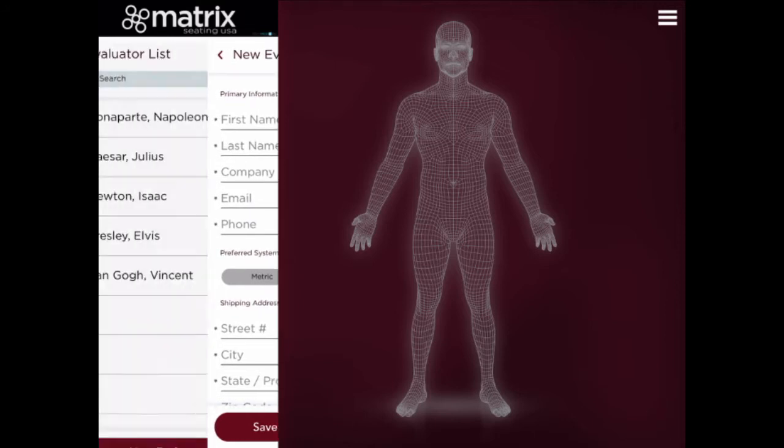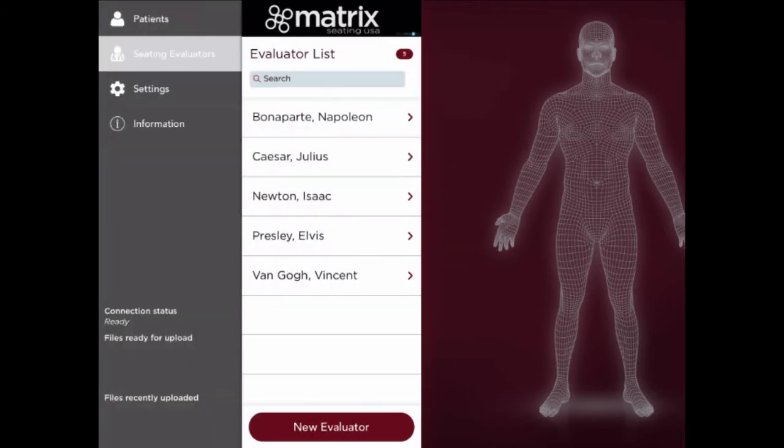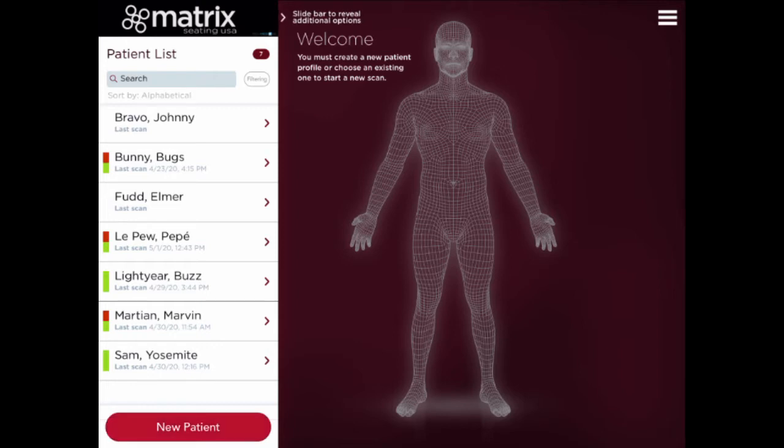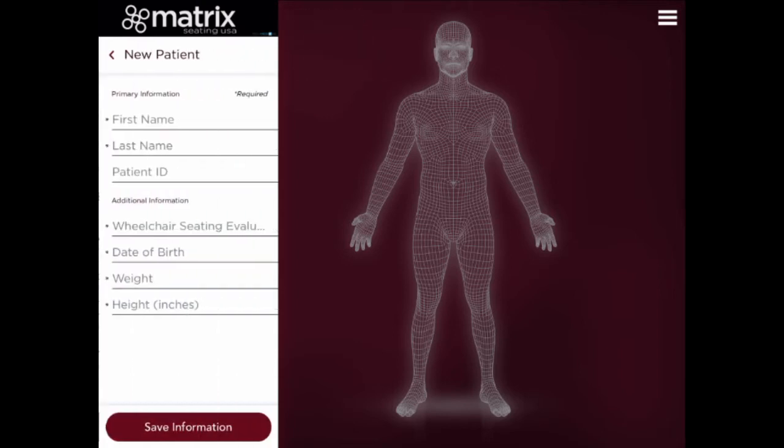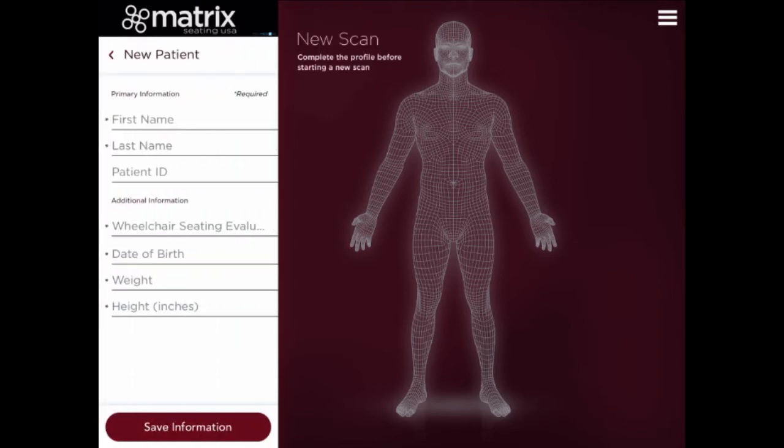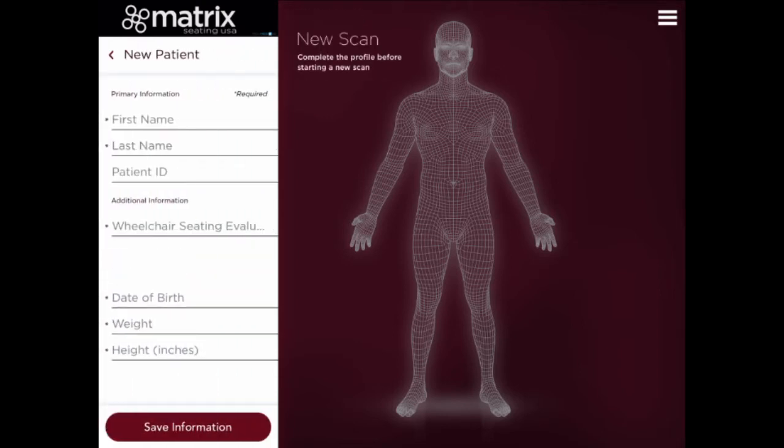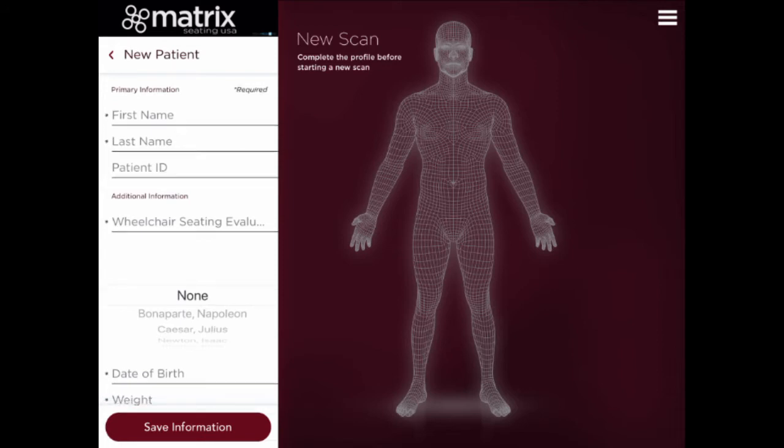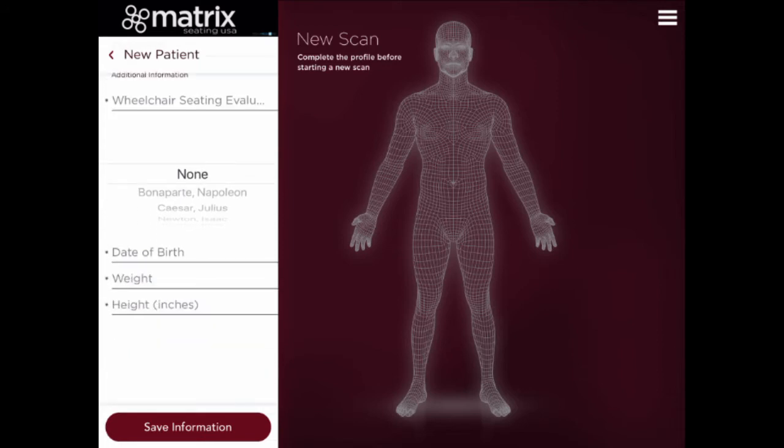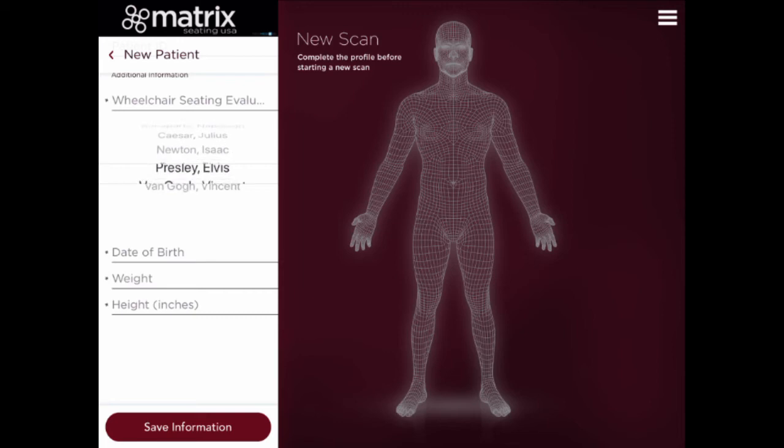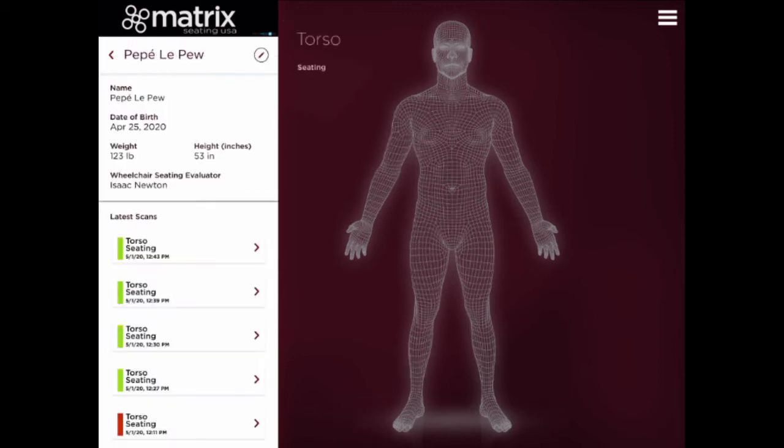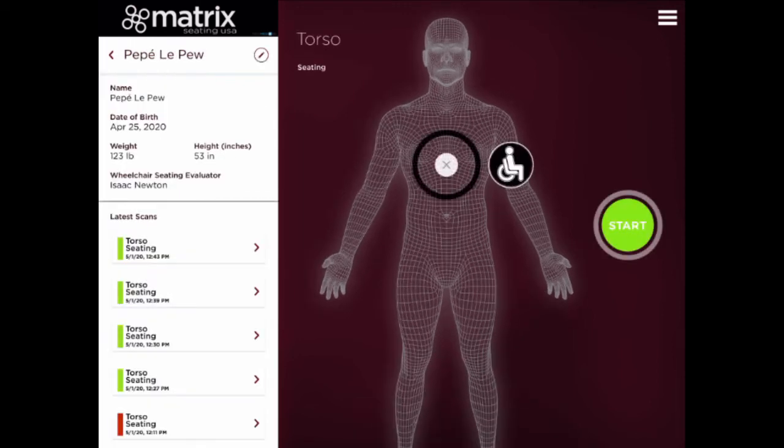Use the slidebar again to reveal the Patients tab. If your patient is not already on the list, click the New Patient button at the bottom of the list to enter your patient's information. When you're entering your patient's information and you get to the wheelchair seating evaluator field, scroll through the list until you find your name. After the patient information profile is complete, simply click the green Start button.